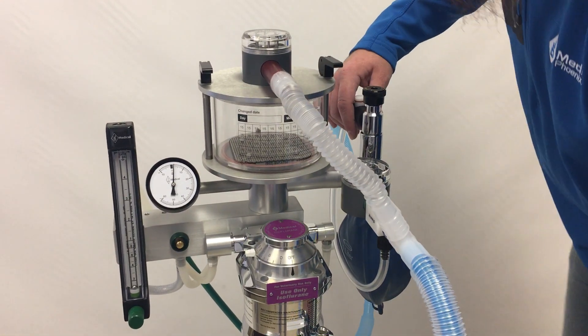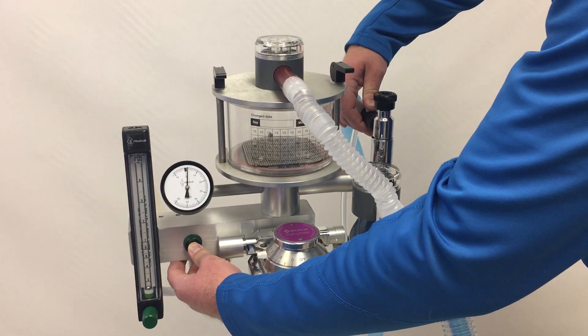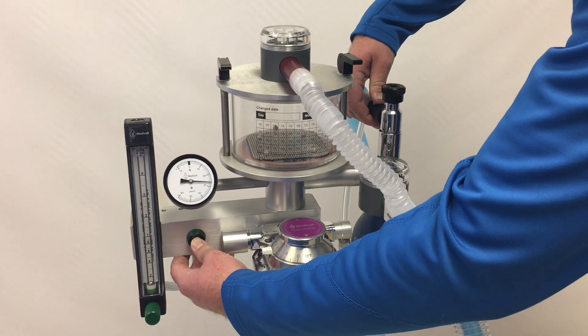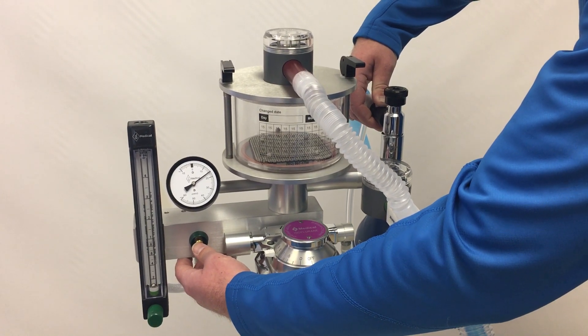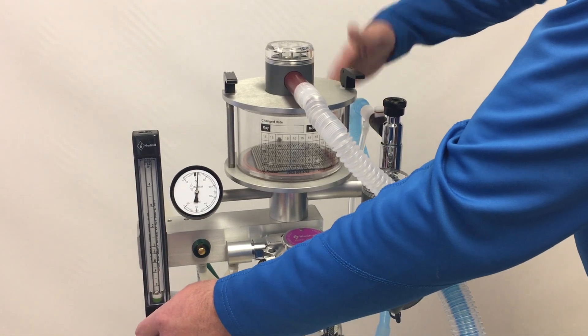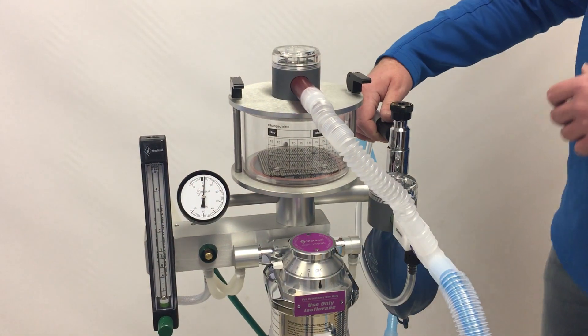The same thing can be achieved with the occlusion valve held down. If pressure goes over the limit, the valve relieves it down to a safe range, giving you time to realize the occlusion valve was depressed and then relieve that pressure.